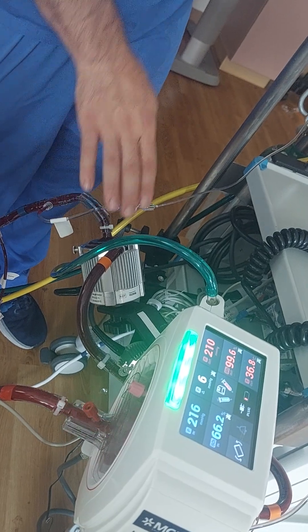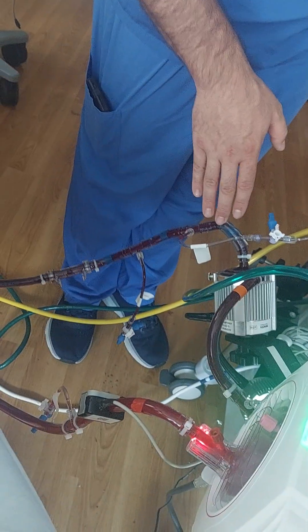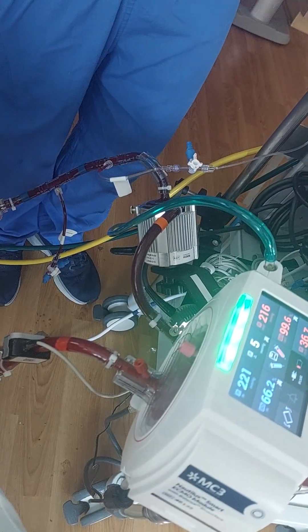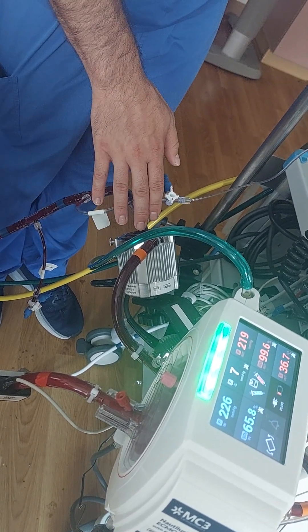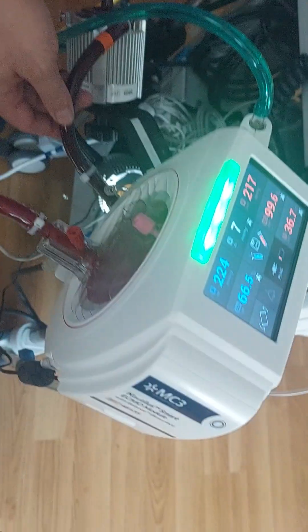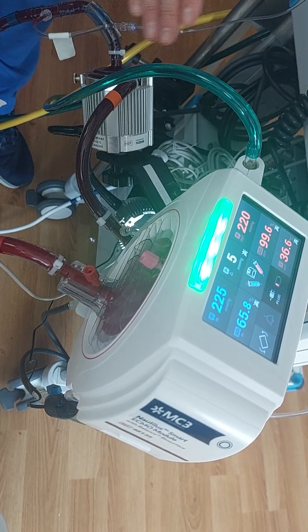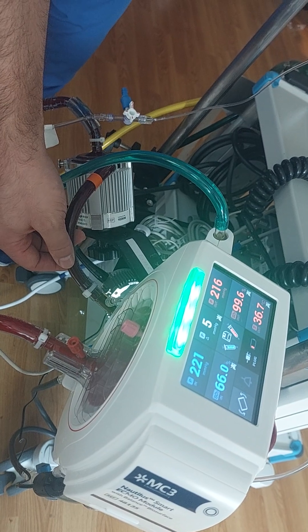This is a centrifugal pump, which works off of a magnet. Inside this Centromag pump head, there's a small impeller. As the impeller spins, it creates a vortex that allows us to siphon or drain the patient — so this is the driving force for the blood. Everything on the venous side is under negative pressure, because as you're pulling fluid out it naturally generates negative drainage pressure. Everything past the pump head is under positive pressure.